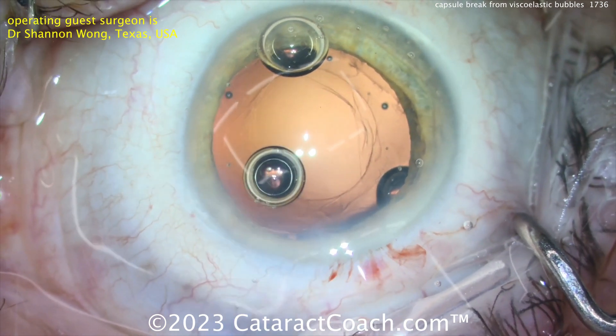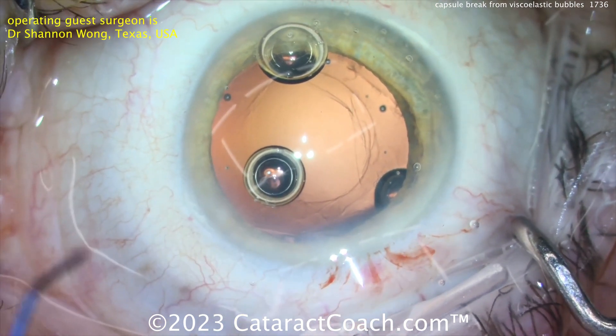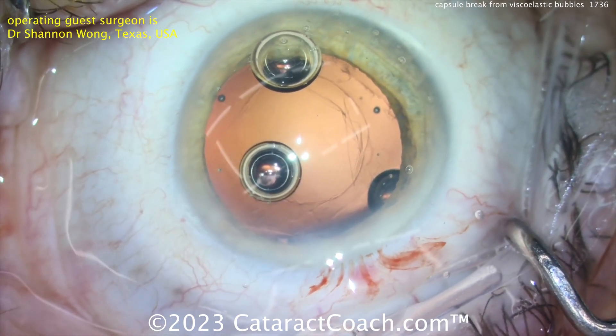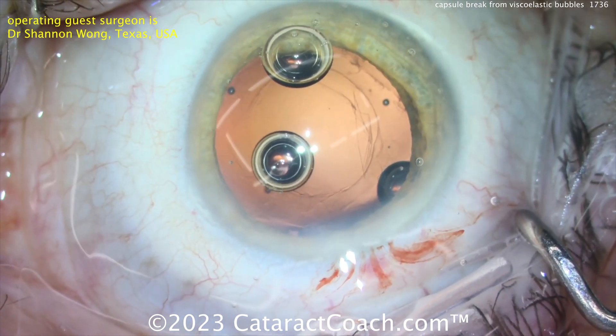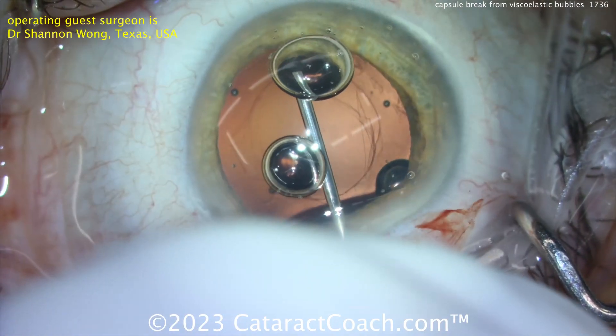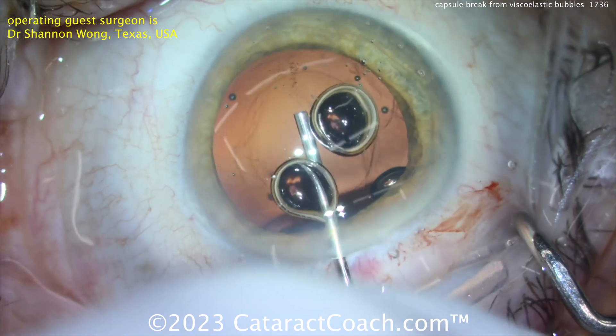That's a tough case, but the good news again is that there is no vitreous prolapse, and there is a tamponade from the viscoelastic that's gone into the eye. Hopefully the anterior hyaloid face is intact, and this patient is going to receive a three-piece lens. Getting more viscoelastic in can clear those bubbles out of the way.